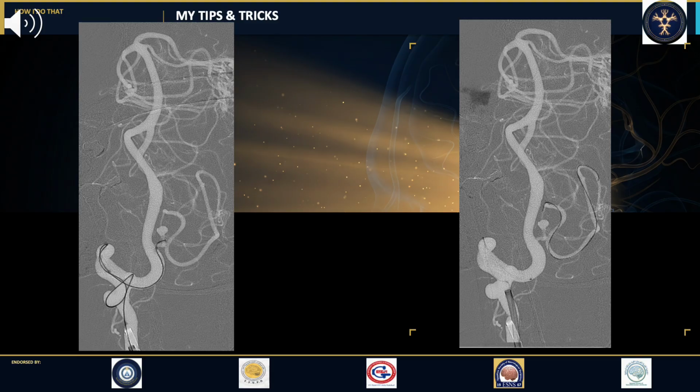Microcatheter navigation. Under continuous fluoroscopic guidance and road mapping, a Medtronic Phenom 27 microcatheter paired with an appropriate microwire is introduced through the 6F guide catheter. The microcatheter is carefully navigated out of the left vertebral artery and selectively advanced into the left posterior inferior cerebellar artery. The tip of the Phenom 27 is positioned distally, safely past the neck of the target aneurysm or lesion.